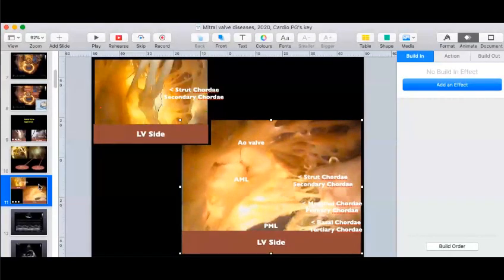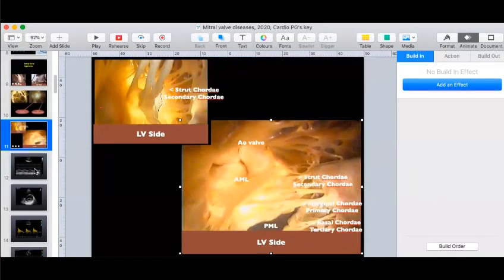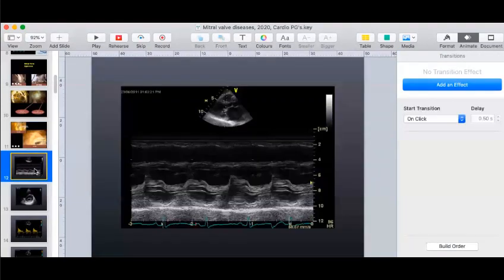So now let me take you through a series of images. And this is where you will have to keep making some comments or any findings which you come across. So what would you start with? So you're shown this image, and how would you like to describe this? This M mode image, the mitral valve level, showing thickening of the AML, and there's a paradoxical placement, like a mitral stenosis, there's anterior displacement of the PML.